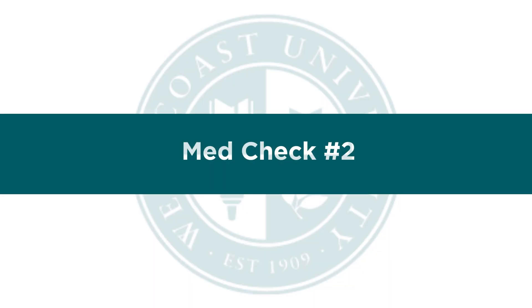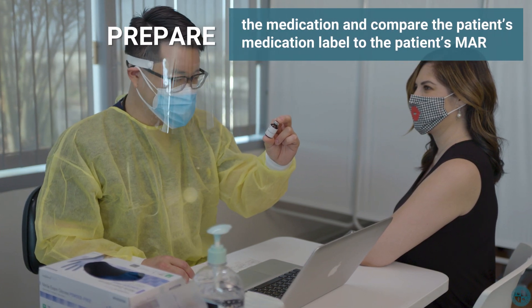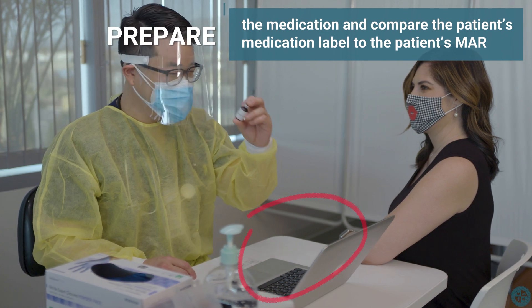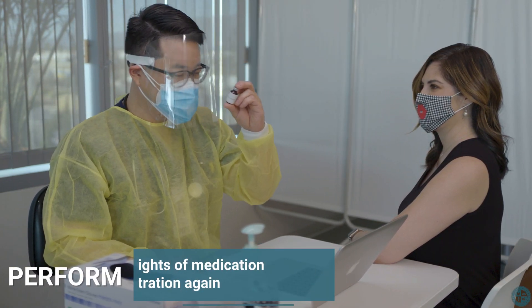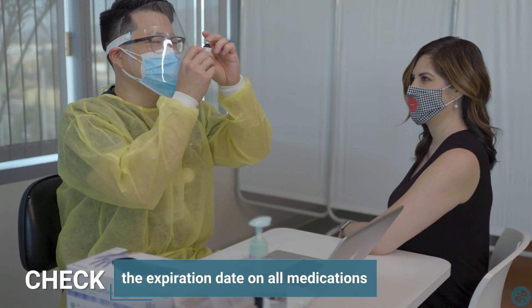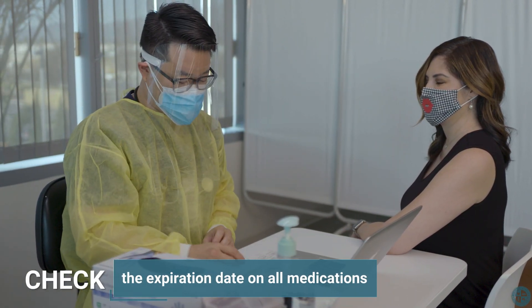MedCheck 2. For the second medication check, prepare the medication and compare the patient's medication label to the patient's MAR. Once again, perform the six rights of medication administration. Make sure to always check the expiration date on all medications.